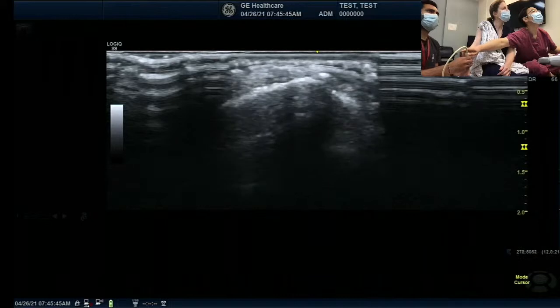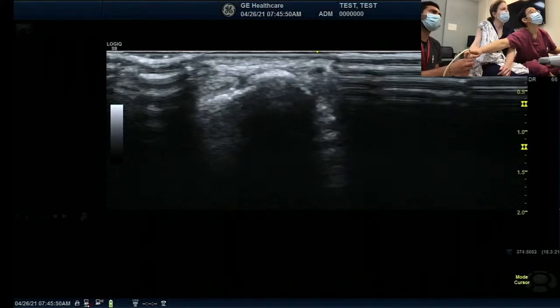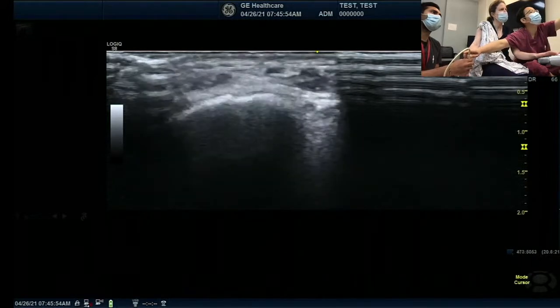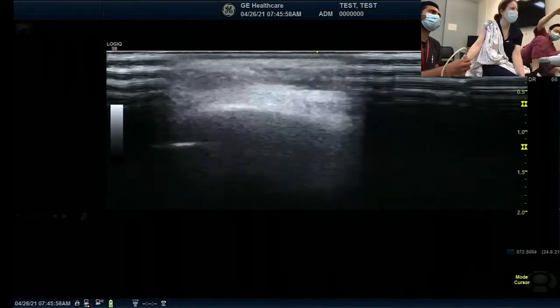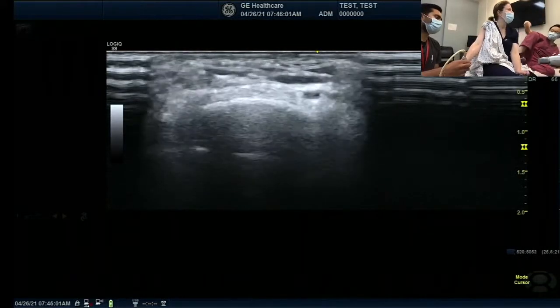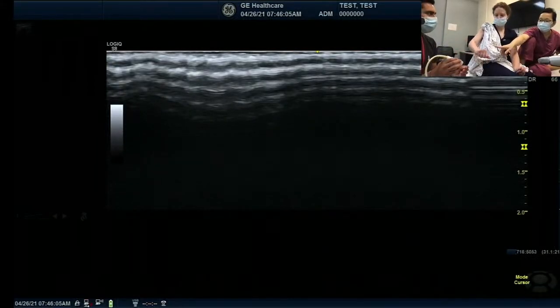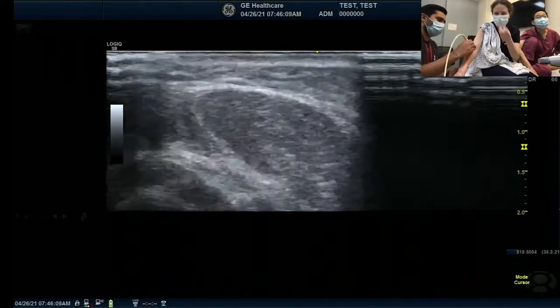This is going to be the one. It has to be so small. Let's do the deep one, just because of the deeper time. Let's put it on your wrist. It's like 7:48 already.